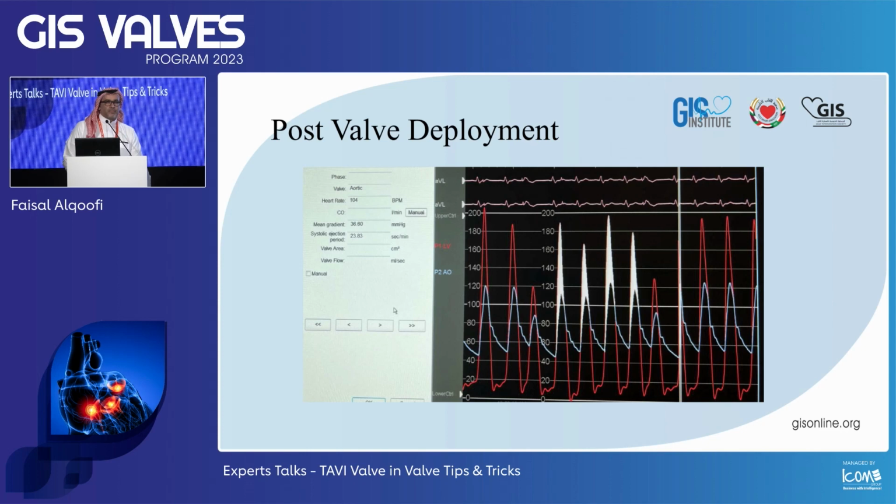Abdullah. And before that, you cannot leave the lab with this result. But you have to understand that the VTC is on the assumption that the valve is not fractured. Now you're going to fracture the valve. That number means nothing. The risk is much higher. So even though you decided not to protect the left main at that point, now if I go to fracture, I will wire the left main and be prepared to protect it.